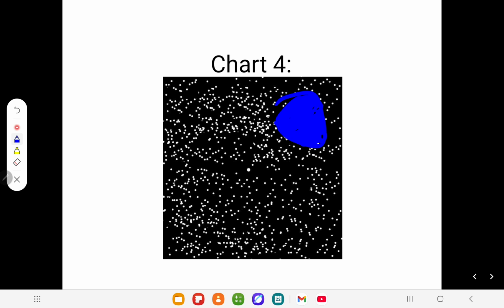But sometimes these features of chart 4 also cause the patient to not find any scotoma because it's random and everywhere. But let's not go into it because we hope the chart is constructed for this and it works. But I haven't used chart 4 in my career, so I cannot say anything. But this is the concept basically.